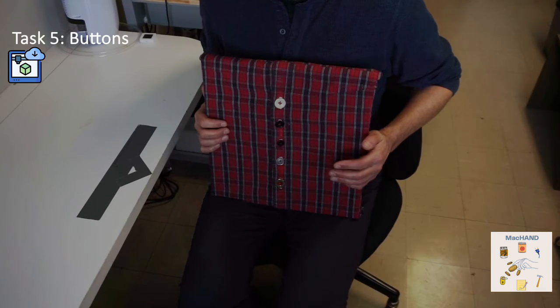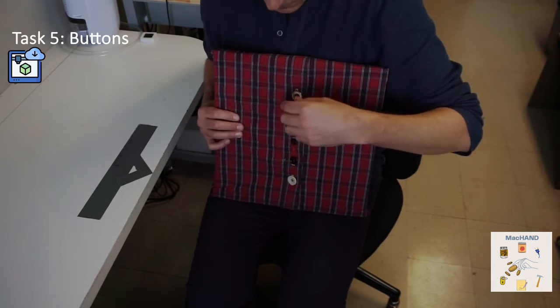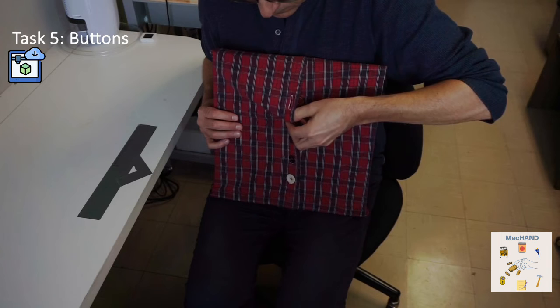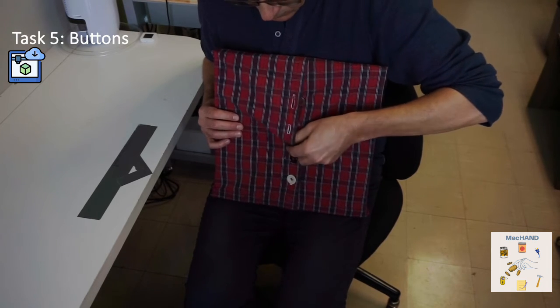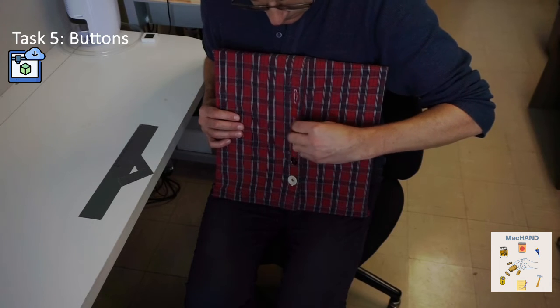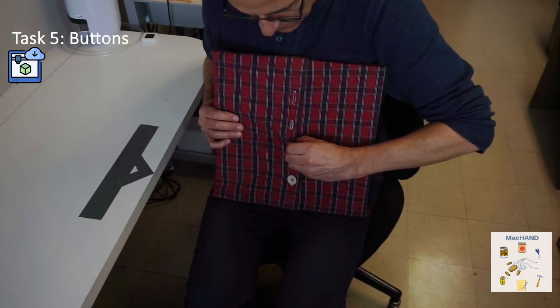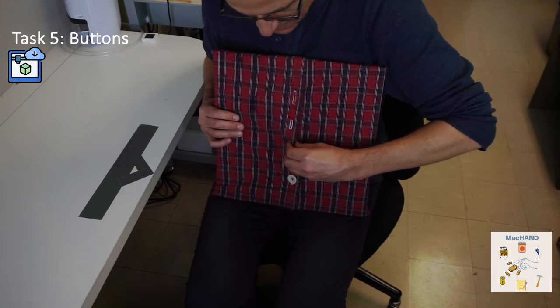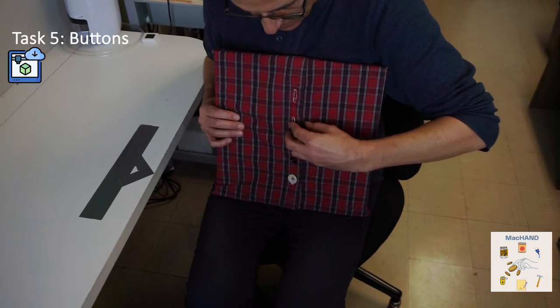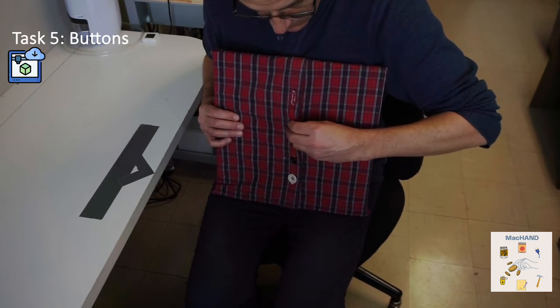Task 5 asks the patient to unbutton the top 3 buttons and to do them up again. There are more buttons on this shirt so that the orientation of the buttons matches that of a man or a woman's blouse. For example, the buttons on a man's blouse are on the right side and on the left side for a woman's blouse. The assessor asks the patient what type of shirt they usually wear before the task is performed, and the board is then flipped accordingly. The buttons of specific size for this task can also be 3D printed if they are difficult for you to find.